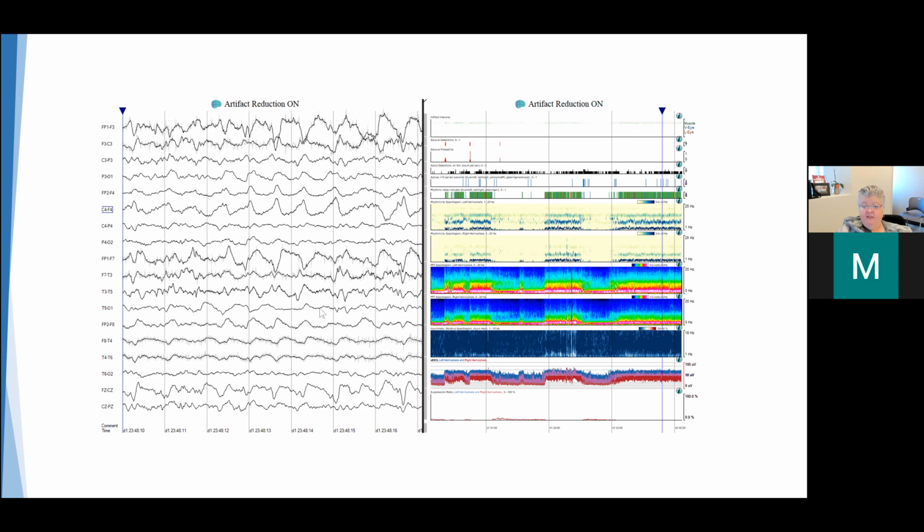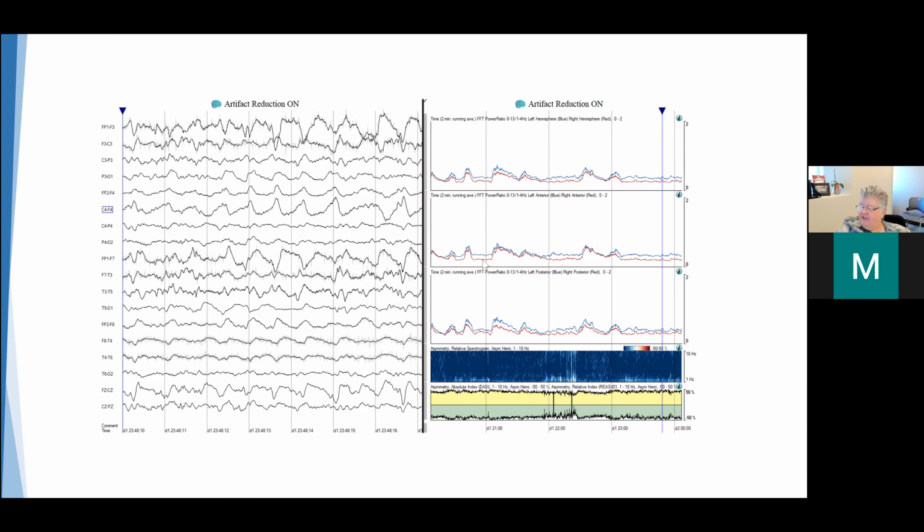And this was related to increased intracranial pressure and transtentorial herniation. So this delta activity actually represents herniation and slowing, rhythmic delta activity over the left hemisphere related to increased ICP. The alpha delta ratio here was actually a little bit misleading because we see just a slight decrease in the alpha delta ratio left versus right because of this rhythmic delta activity. The asymmetry was not as great as you would have expected.